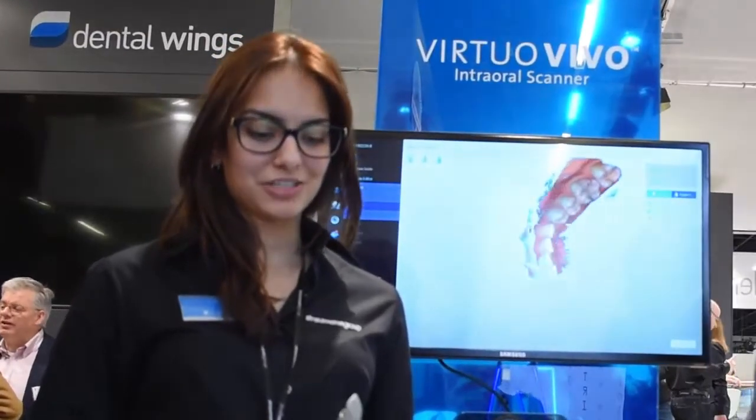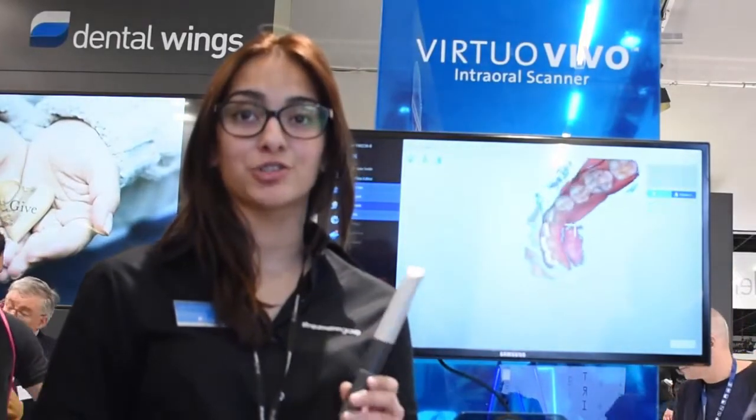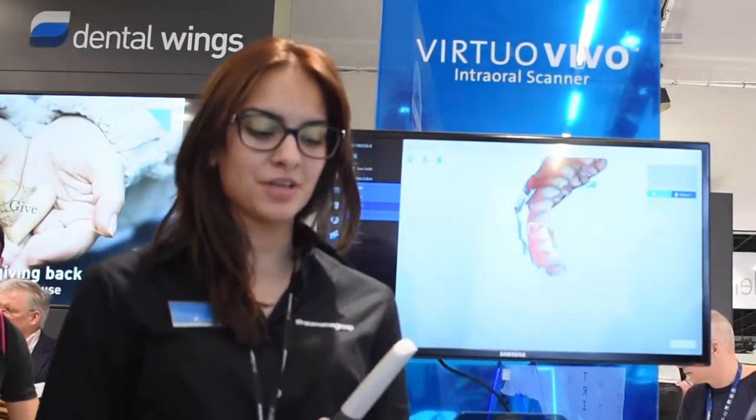Sarah's going to tell us a little bit about the new intraoral scanner. So today at IDS 2019, we're introducing our Virtuo Vivo intraoral scanner. What's unique about this scanner is that today it's still one of the lightest and smallest handheld devices.